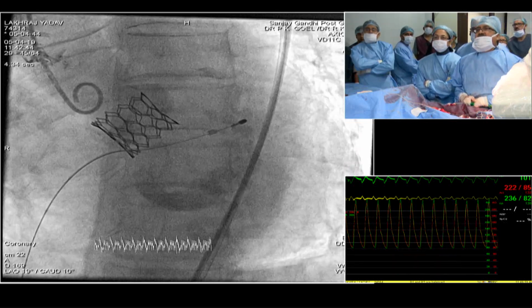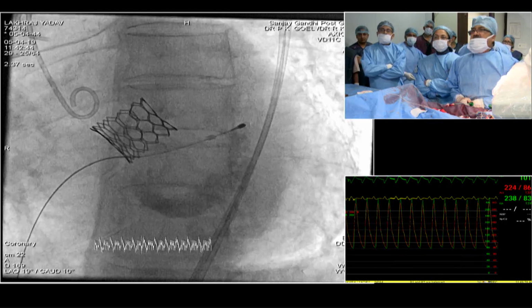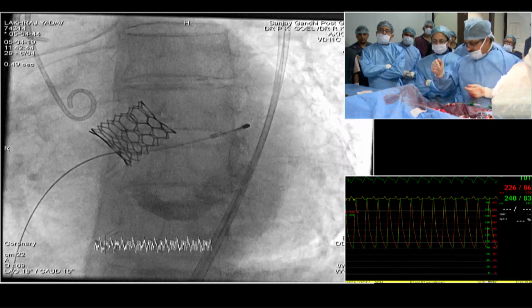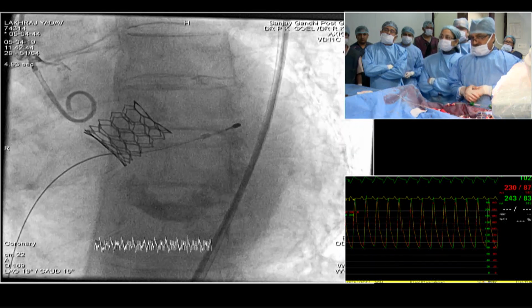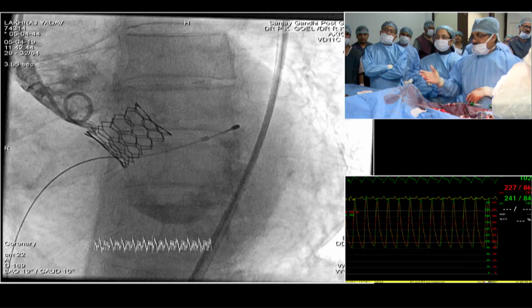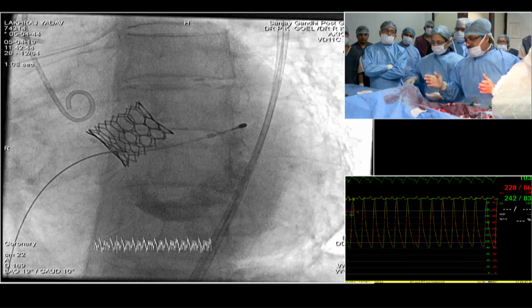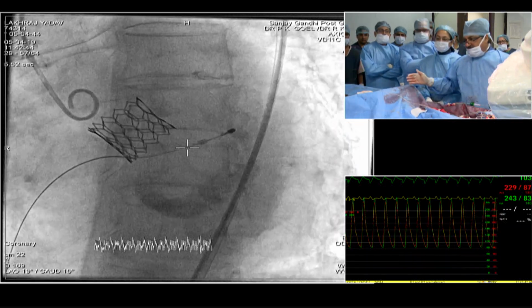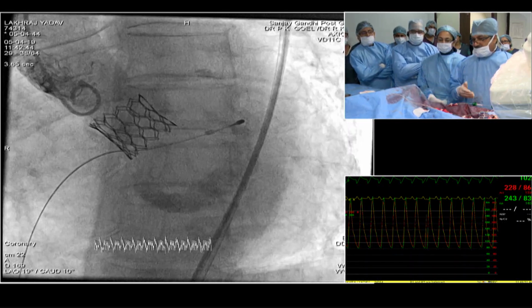Can you see that? The coronaries are also filling well. I don't think this is more than mild. At that time, the catheter was right deep into the sinus, and maybe it was distorting it to some extent. But right now, the valve is fine, and there is no AI. The pressures are okay. What I learned out of this was that with the wire in, we can't wait for 25 minutes like I had to, because I had crossed the valve just before getting live.